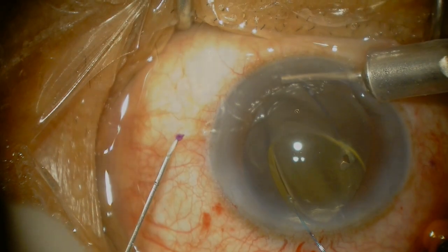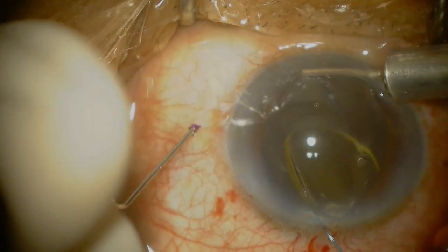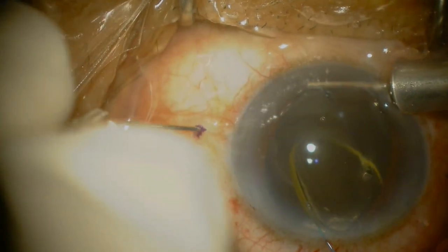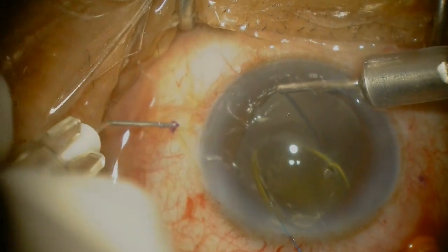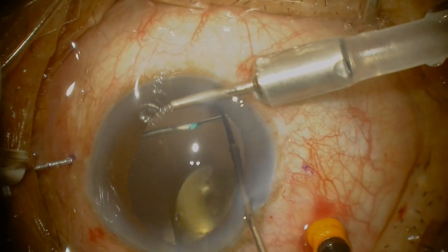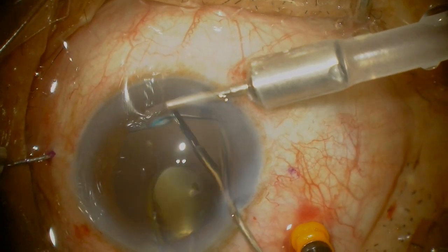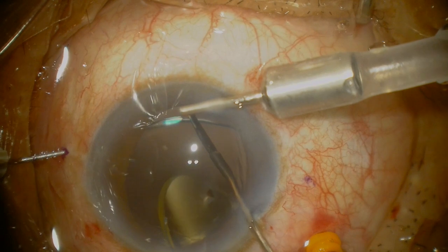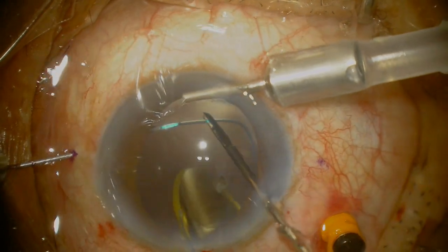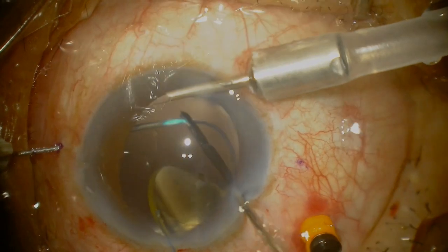I have put the intraocular lens into the anterior chamber. Now entering the eye, I will go relatively flat to the surface of the eye, angled slightly parallel to the limbus, go in until I see the marking on my needle and then dive down towards the optic nerve. Using a 25 gauge forceps, I grab hold of the haptic near the tip for good control and then pass it into the needle. They should pass in quite easily.